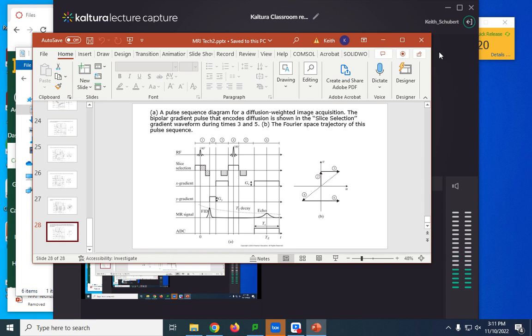We can do some of it with infrared cameras. If you've seen the motion laboratory on the first floor of the Brick, you can see some of those infrared cameras they use to track motion of people. We will sometimes put cameras like that around patients being imaged, depending on what system it's in. For instance, with our proton ones, we actually sometimes use those exact cameras.